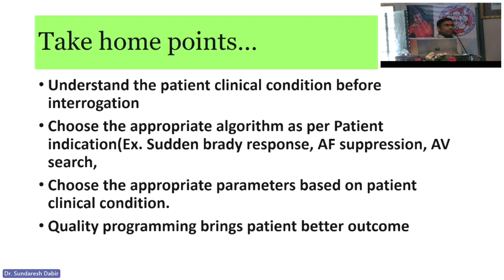For AV delay, you can't just keep it fixed at 200 or 150. We should also keep rate response AV delay and all that. Quality programming brings the patient a better outcome. I believe that when you learn everything and have knowledge, quality programming comes automatically. You can do the needful for the best. Thank you.